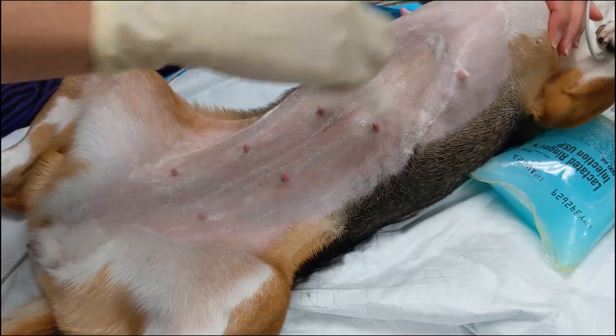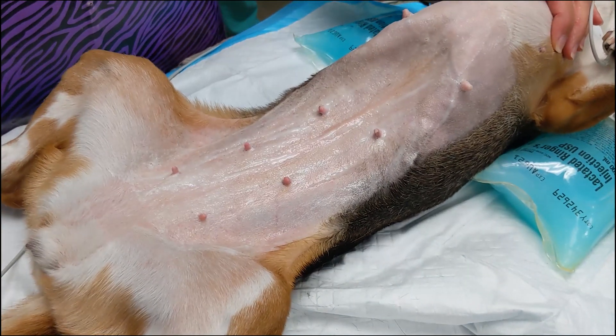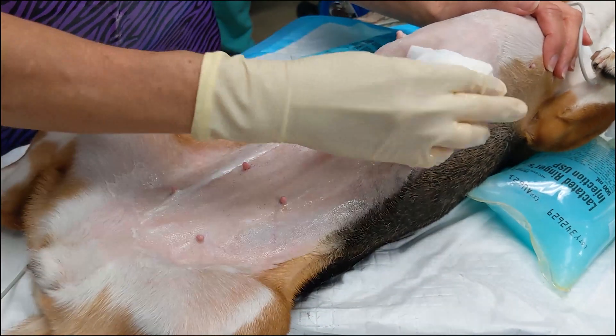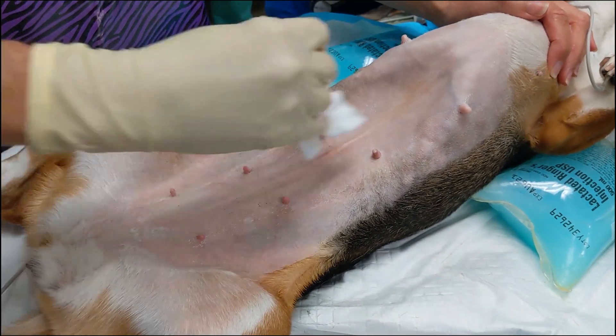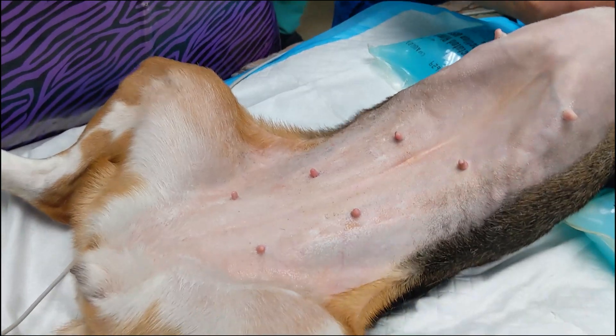Alternating rounds of chlorhexidine scrub and isopropyl alcohol or sterile saline are applied to the clipped surgical field. For the dirty prep, the direction of the scrub is not as important as it is in the sterile prep. The point is just to get as much dirt, debris, and hair off of the surgical site as possible before getting into the OR.